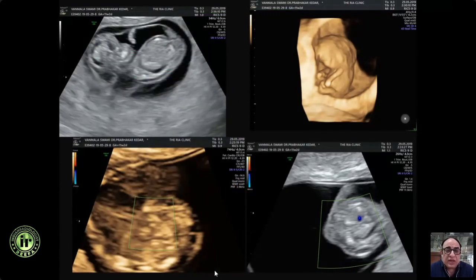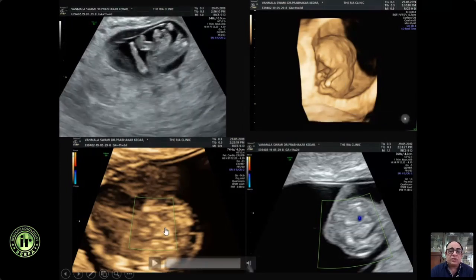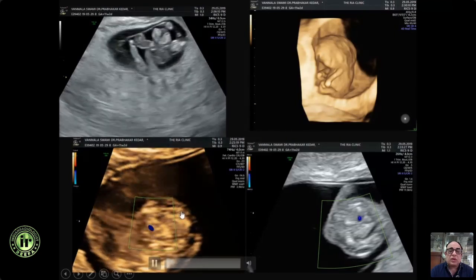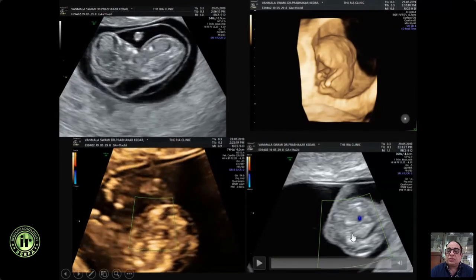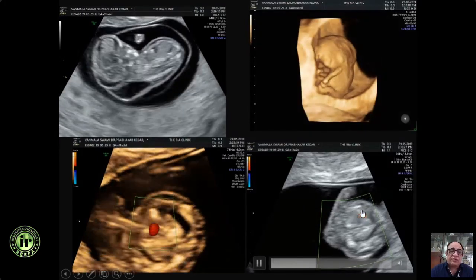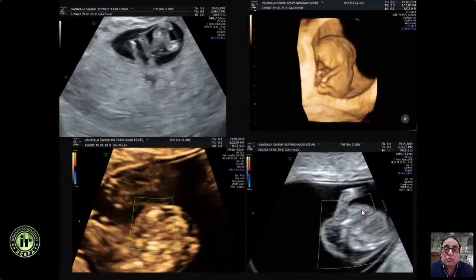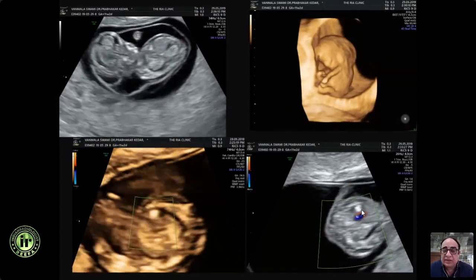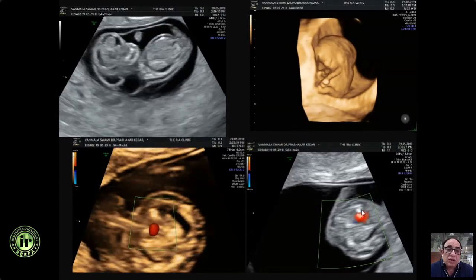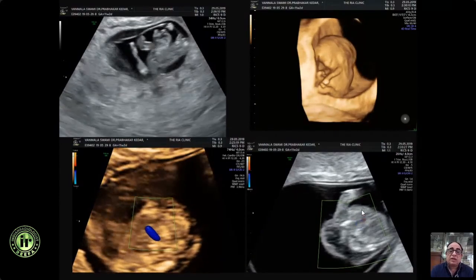So it's very important that we keep pace with all the interventive and genetic tests. Now you can see here, this is a fetus with nuchal edema and a little bit of hydrops and short limbs. There is also a cardiac abnormality and some echogenic focus here in the heart. And we did a CVS here. No point in giving this fetus an NIPT. So the moment you have a structural defect like this, this does not only increase the risk for aneuploidy, but there could be multiple other abnormalities.